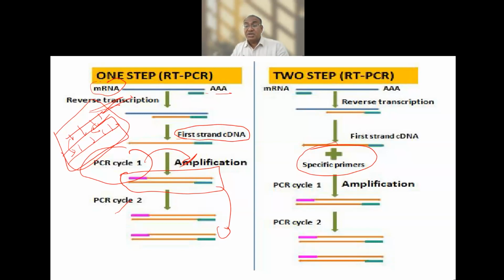How do I look? Because the physician, depending upon his signs and symptoms, will think that the person is suffering with viral hepatitis. So which type of virus? It might be HBsAg. Whether this hepatitis virus is A, B, or C is a different issue. But I know with the clinical symptoms. So when they write that they expect this, we use this primer in the diagnostic part. So for me it is very easy.